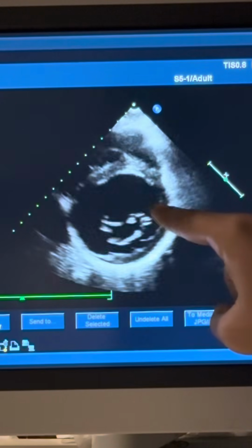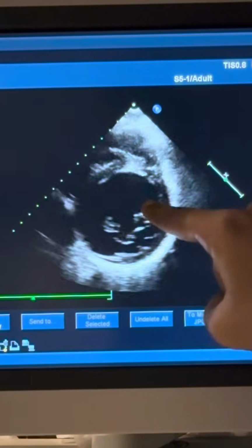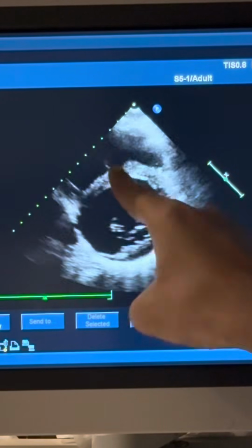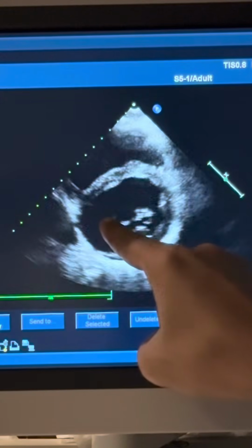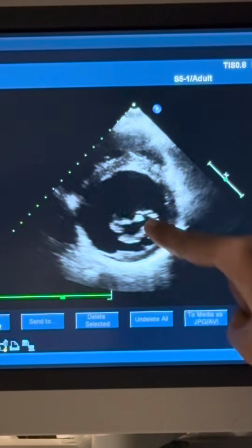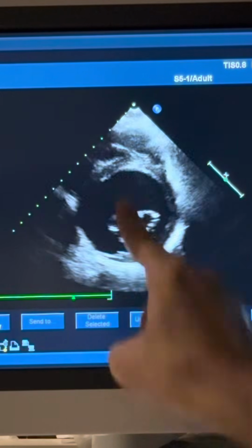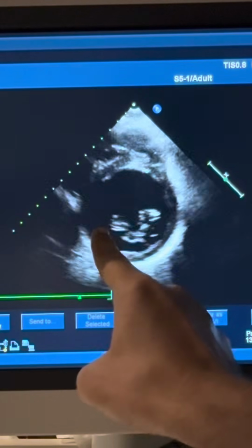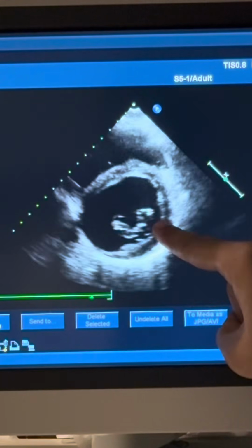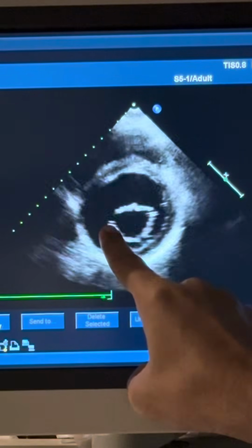Anterior leaflets take the letter A, so A1 counting from lateral to medial, and then A2 right in the middle below the aortic valve, that should be here, and LVOT, and A3 near the septum. And the same for the posterior leaflet. P1, the most lateral one, P2 just beneath the LVOT right in the middle, and then P3. So the anterolateral commissure will be A1 and P1. The posteromedial commissure will be A3 and P3.